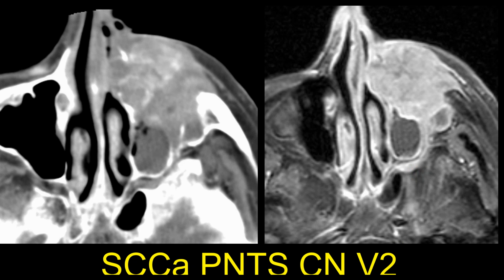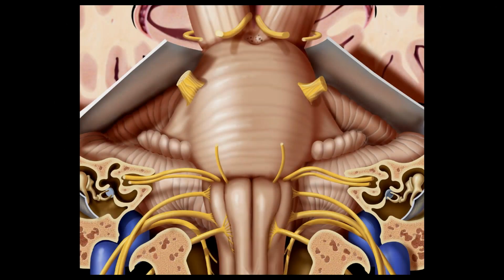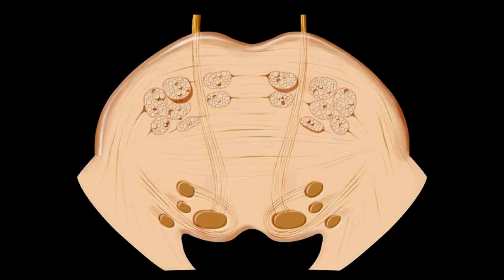Under every foramen of the skull base, we want to see a nice fat pad. So for each of those cranial nerves, we think about imaging from their origin nucleus all the way out through the end organ. And we can think about the middle nerves, 5 through 8, having their origin within the pons, 1 through 4 being in the midbrain or mesencephalon above, and 9 through 12 being below in the medulla. So for example, if we think about a cross-section of the pons and where the fourth ventricle is posteriorly, we have the central cranial nuclei below that.